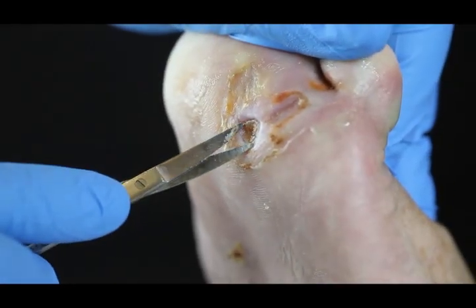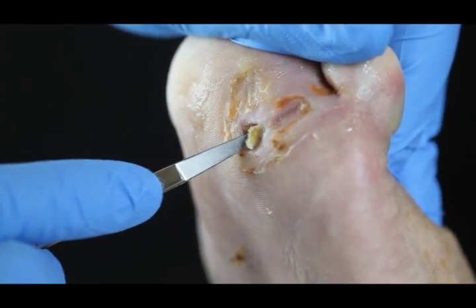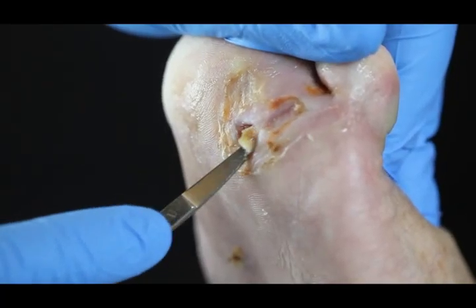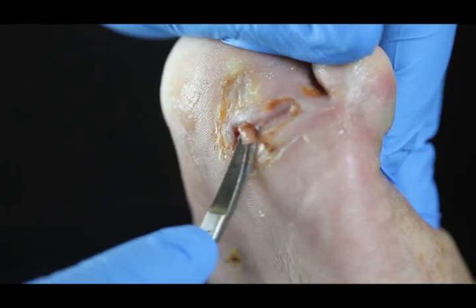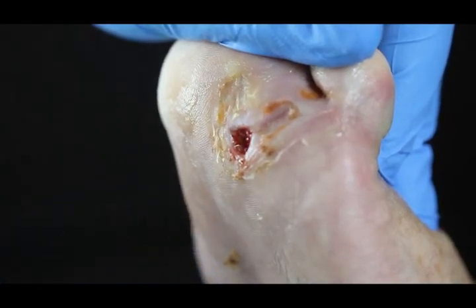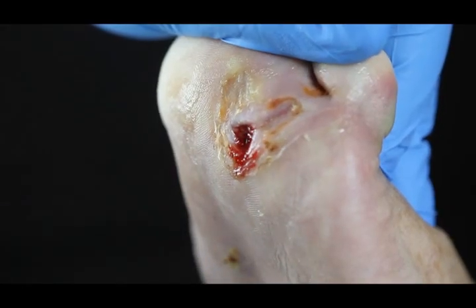Once we get the callus done, then what we're going to do is take the biofilm off the surface of the wound. There is surface-associated bacteria on all chronic wounds, and we've proved that in multiple different ways. So that was the area that we just took off.